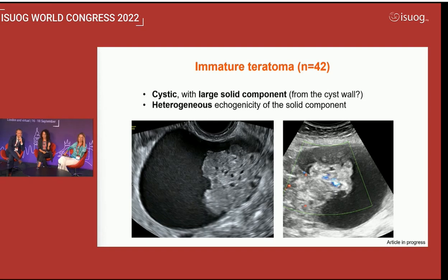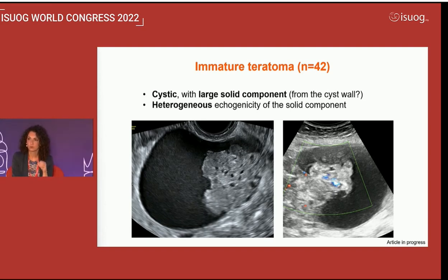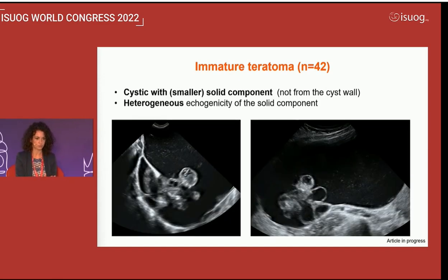So you can see some vascularization, which is not so increased. So you can usually have a vascularization like color score 2, minimal vascularization, or moderate vascularization, which is something not typical of dermoid. So presence of vascularization, but not so rich vascularization, which is something that you would expect in a malignant lesion. And here it's just minimal or moderate vascularization.